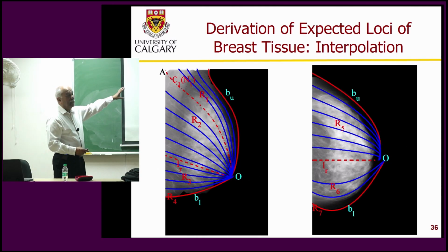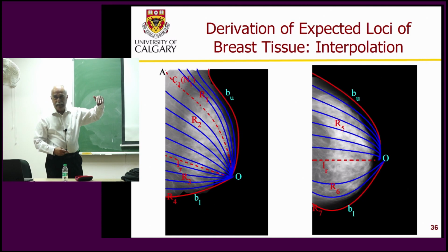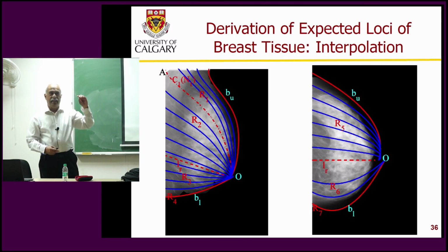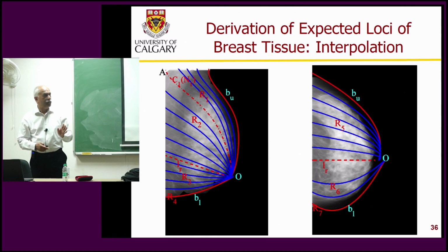This says, according to our model of the breast, the orientation should be like that in the window. What is the difference between the two? If there is disagreement or lack of coherence, then there is some suspicious structure. So mark all the suspicious areas like before using node map analysis, and then train pattern classification. The rest of the story is the same.